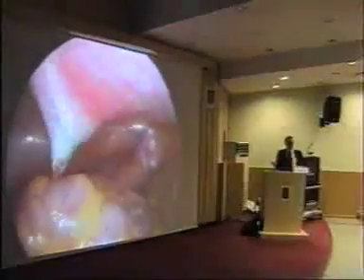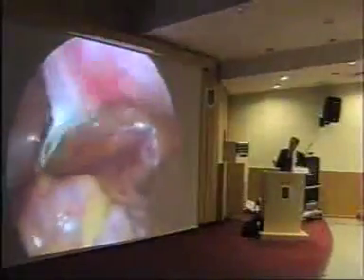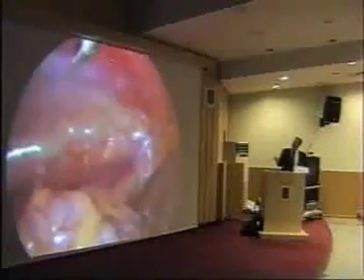I'll turn the music off. Okay, so this is the access for transperitoneal nephrectomy. The patient's on this side, the head's up this end, the feet's down this end, and this is a circumumbilical incision here, and this is the edge of the rectus sheath. In the right outlet, this is the anterior superior iliac spine, this is the rib cage, and there are two working ports here. This is the umbilical port, and I've tended to use a larger port for the umbilicus because then I can use the Endocatch basket to take the kidney out. I always use an open technique for the umbilical port, and these are the accessory ports just going on.